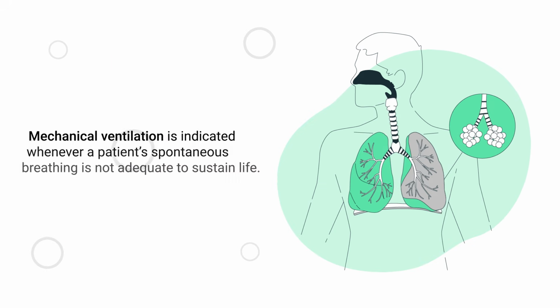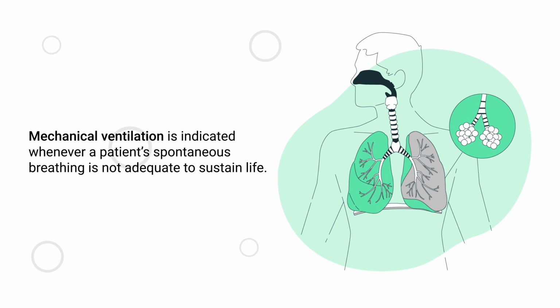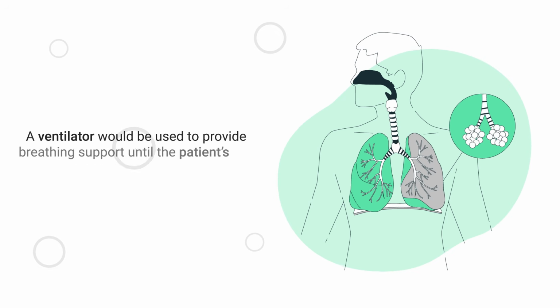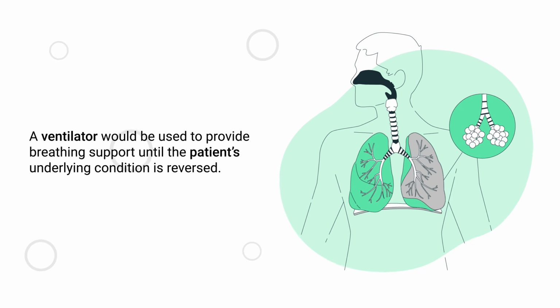In general, mechanical ventilation is indicated whenever a patient's spontaneous breathing is not adequate to sustain life. In such a case, a ventilator would be used to provide breathing support until the patient's underlying condition is reversed.